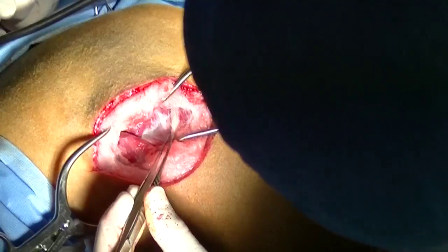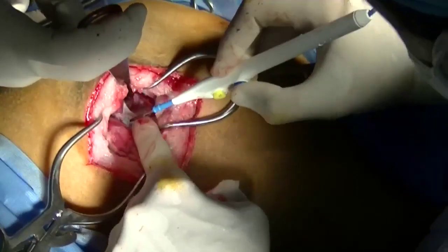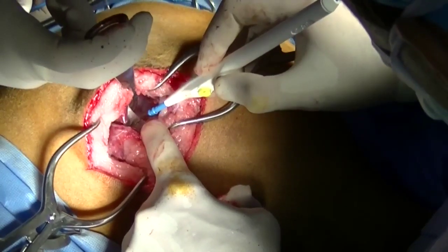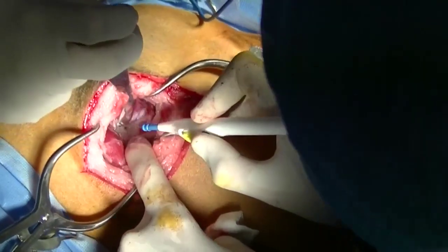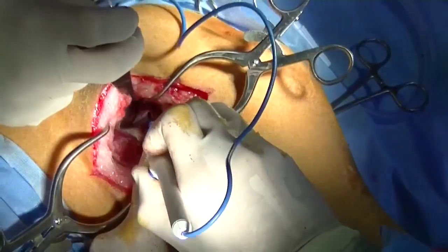The middle gluteal muscle is separated from the tensor fasciae latae and then a Hohmann retractor is introduced dorsal to the ileal shaft. I like to completely expose the ileal shaft, as this facilitates making the cut and also placement of the plate.